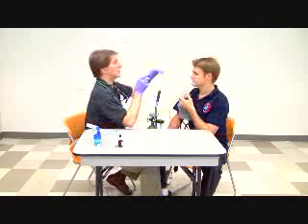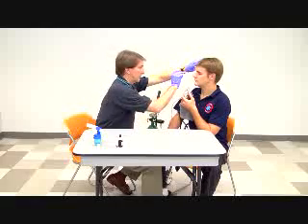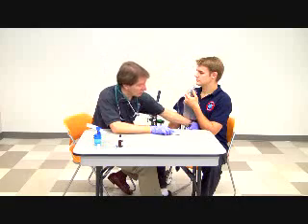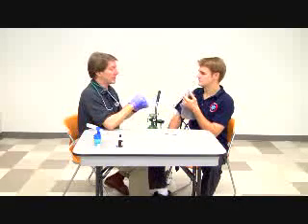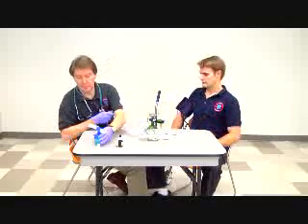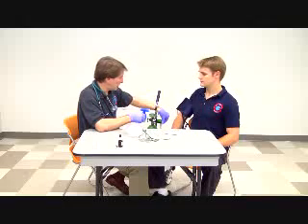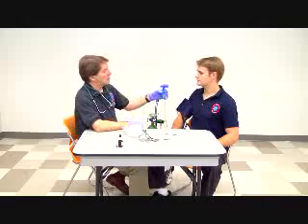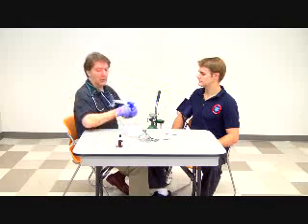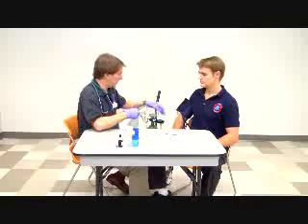Okay, close your eyes and look straight ahead. All right, I'm going to check the patient's skin temp, which is still warm and dry. Okay, assuming the vital signs are still okay, we're going to remove the high flow oxygen, place the patient back on the nebulizer at 6 liters per minute. We're going to finish the second half of the medication, take the patient off the nebulizer, back onto the high flow at 10.